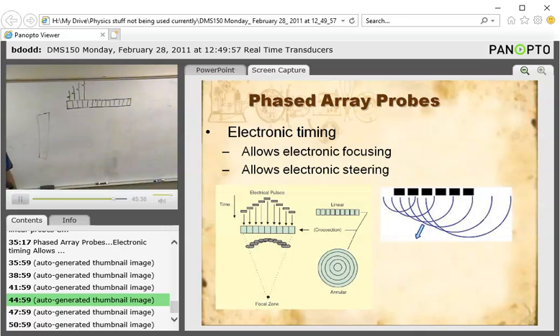But then it also changes the direction of the beam. Yeah, it does that automatically. It takes care of it. When you're doing vascular stuff, I've seen them choose like one focal zone or 2 to 5. Yeah. Anytime you have multiple focal zones on your screen, you're using a phased array transducer of some kind. Absolutely.